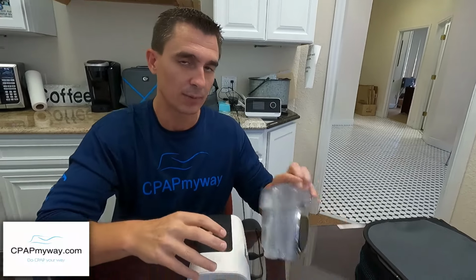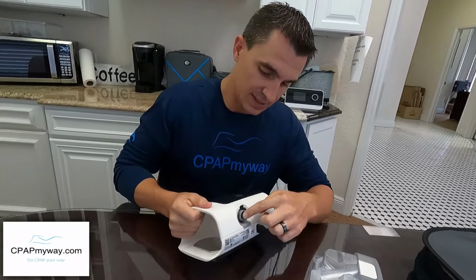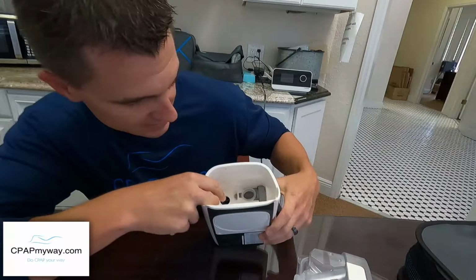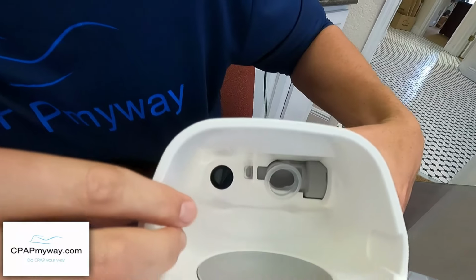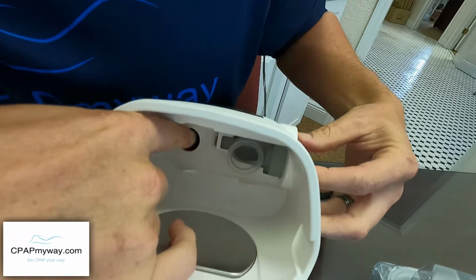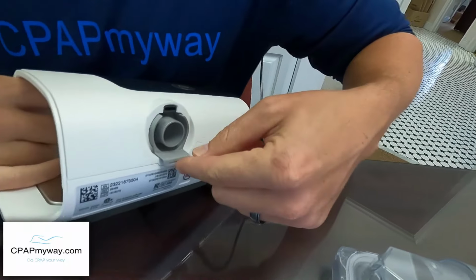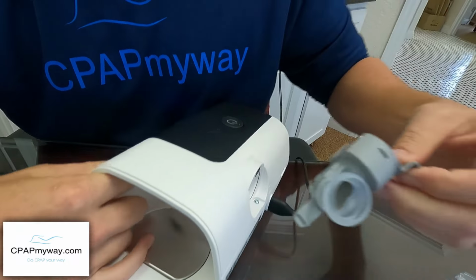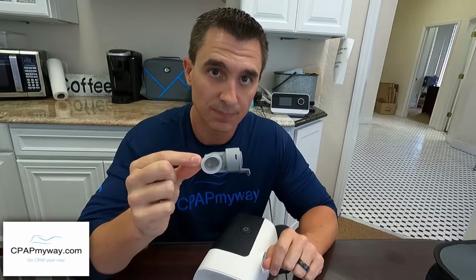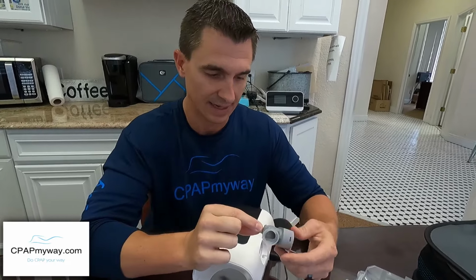So you have to wash your chamber at least once a week, okay, soap and water or top rack of the dishwasher. But additionally, the seal here, the air outlet seal, needs to be washed as well. So come in here nice and tight. You'll see there's a little tab down in there. And so if you press that tab, a little release, it'll allow you to pull. There's even a little lip on the back here, so you can pull this air outlet seal out. This needs to be washed as well. It's very easy to take in and out, as you just saw.